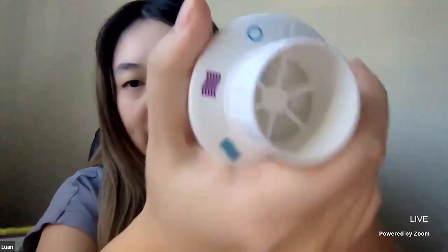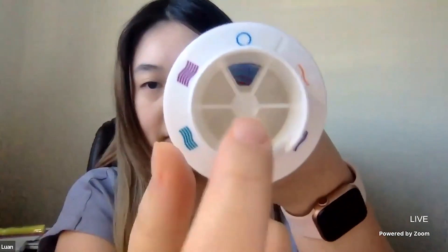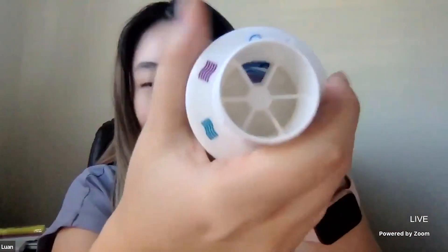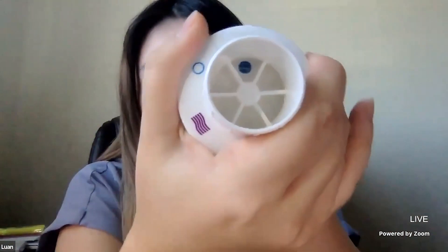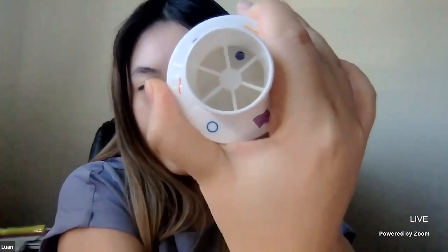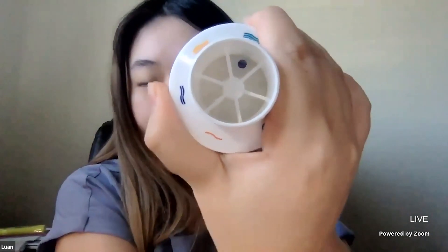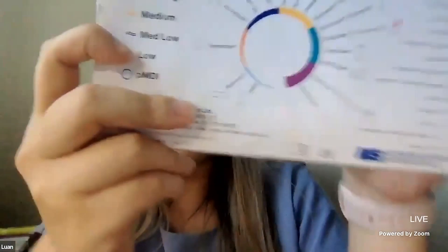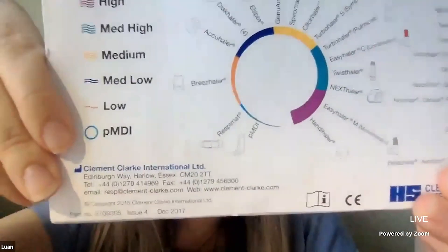This is a device that measures different resistances with the patient. Looking at the dial top, in the beginning the hole is very big, which reflects the lowest inspiratory flow rate required for the patient. As we go counterclockwise, the hole gets smaller and smaller, reflecting the higher inspiratory flow rate required for patients to inhale. The manual shows what type of inhaler corresponds to each pattern shown on the dial top.